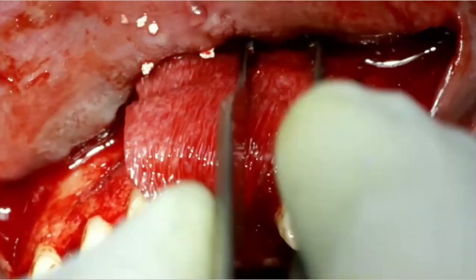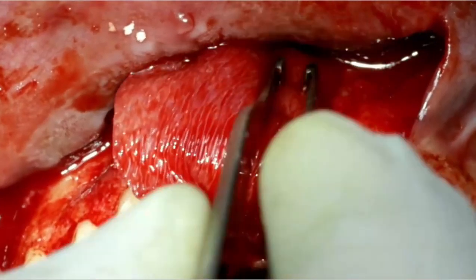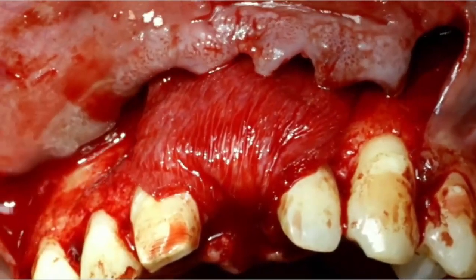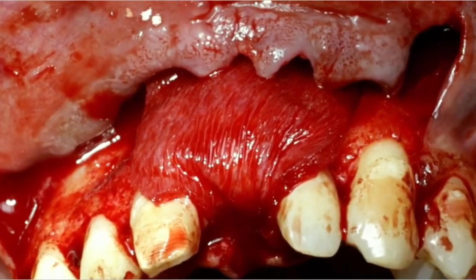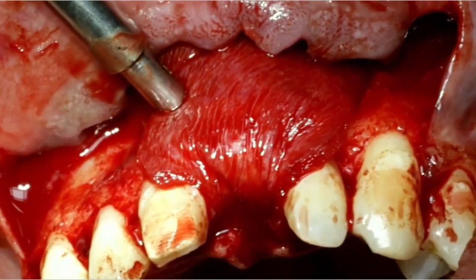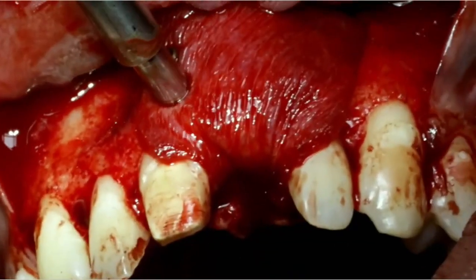Adaptation of the collagen membrane and fixation of it with pins. Bone stability and membrane fixation.